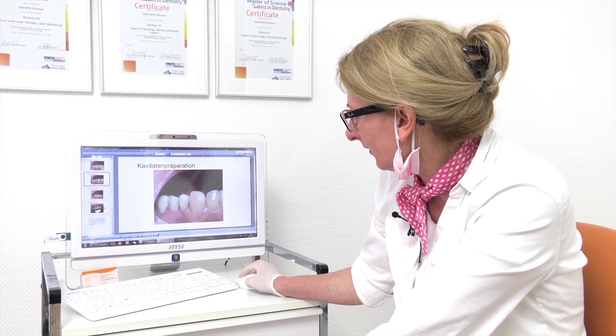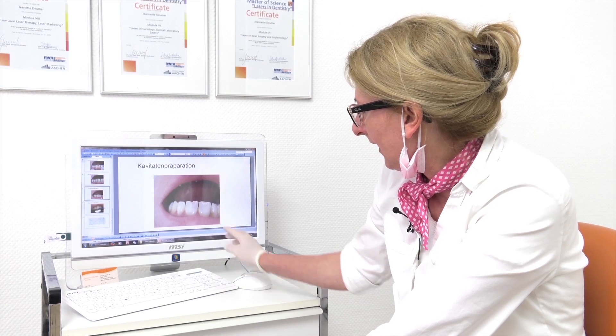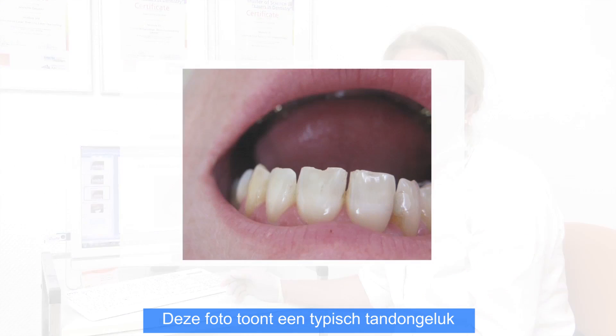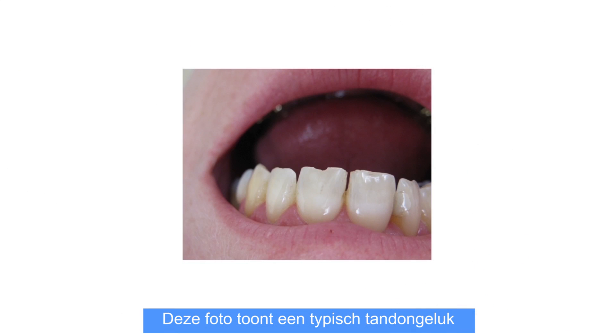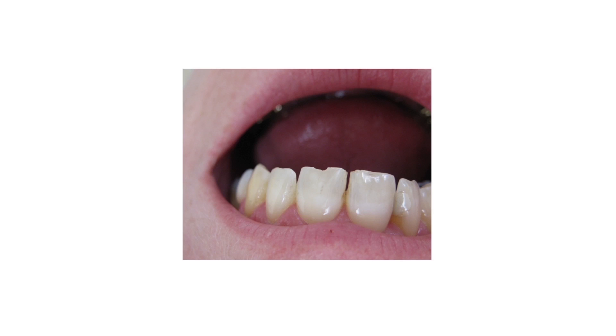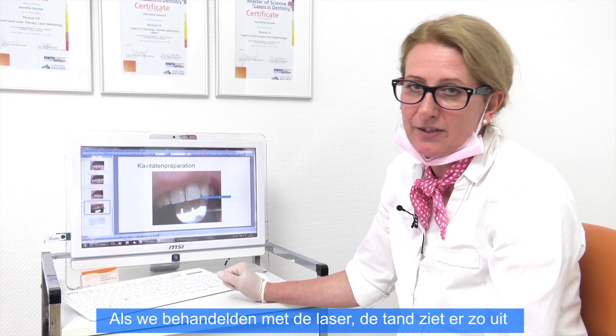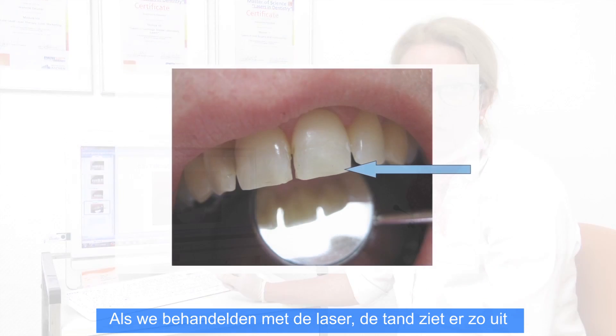It's a typical accident where the incisor was broken. And when you treat it with a laser it looks like this, before you polish the filling.